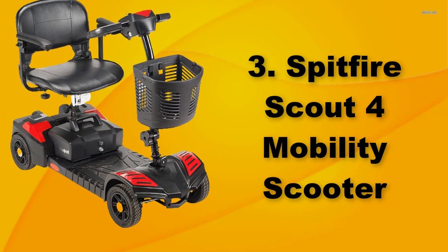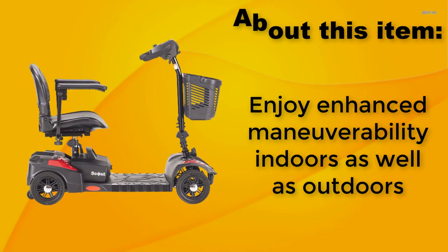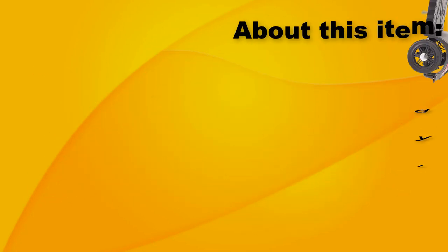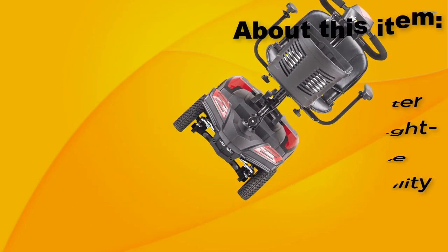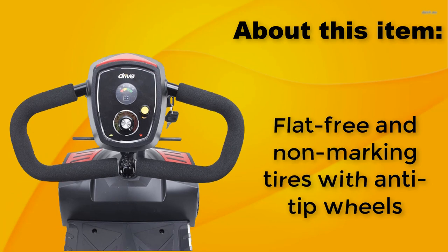Spitfire Scout 4 Mobility Scooter. Enjoy enhanced maneuverability indoors as well as outdoors. The chair scooter features a height adjustable swivel mobility seat. Flat free and non-marking tires with anti-tip wheels.